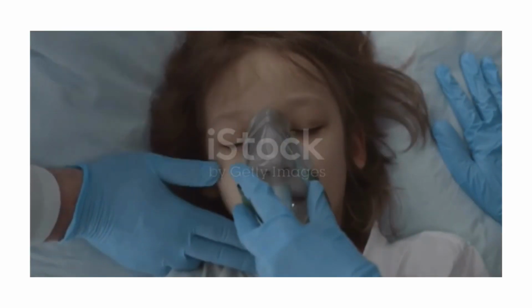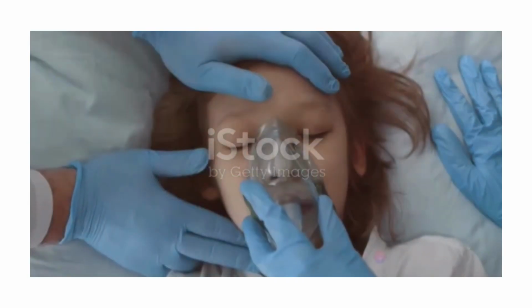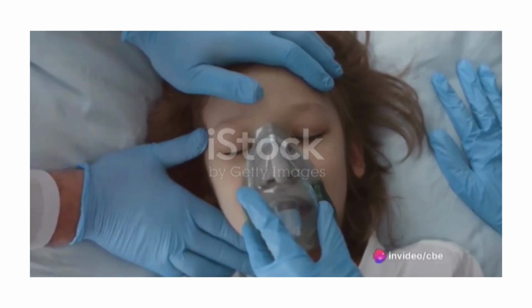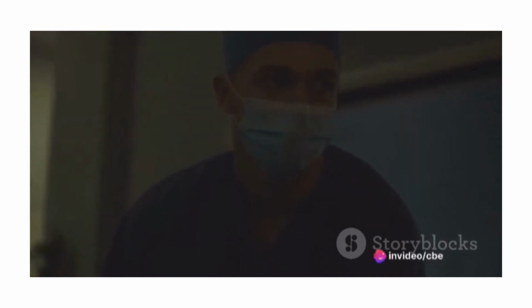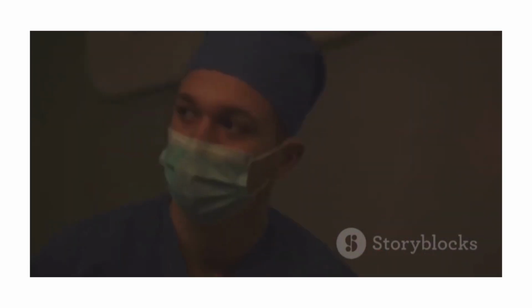First, the healthcare team carefully evaluates the patient's readiness for extubation. They take into account several factors such as the patient's level of consciousness, ability to protect their airway, and overall health status. It's a decision that is never taken lightly.